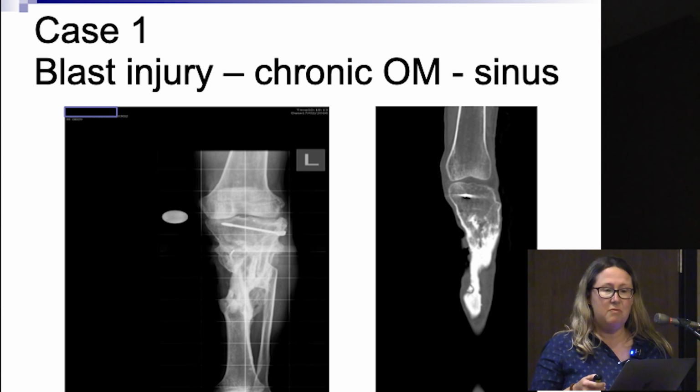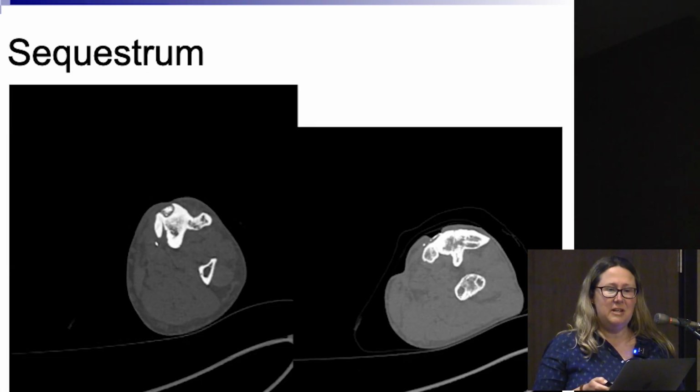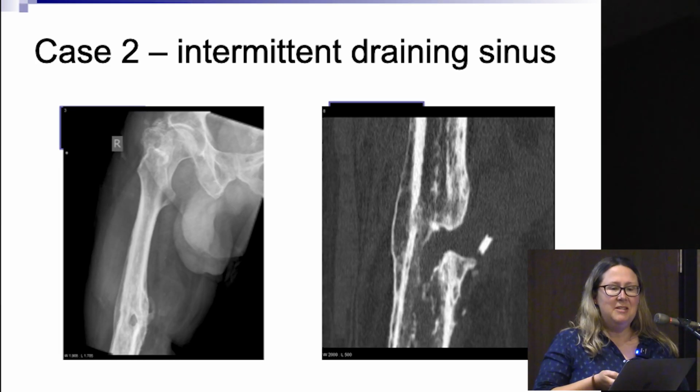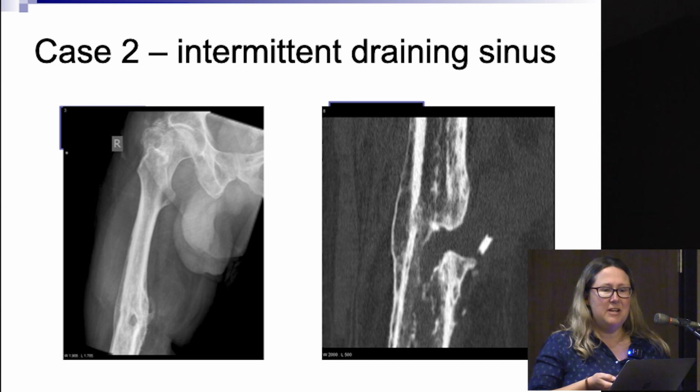That's the beauty of the 3D reconstructions. You can reconstruct them in any plane you want. And again, that's just in the axial plane. If trainees work in York, the only things they send you are the axial slices, and you then have to try and use your vivid imagination to make the coronal and sagittal reconstructions. Good luck.